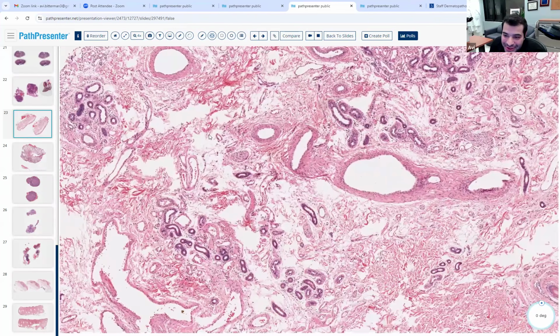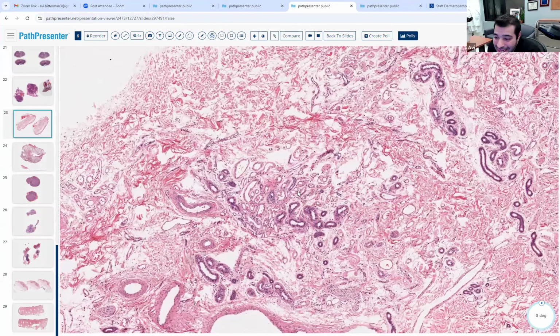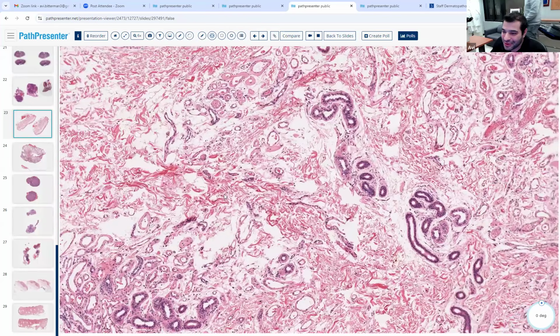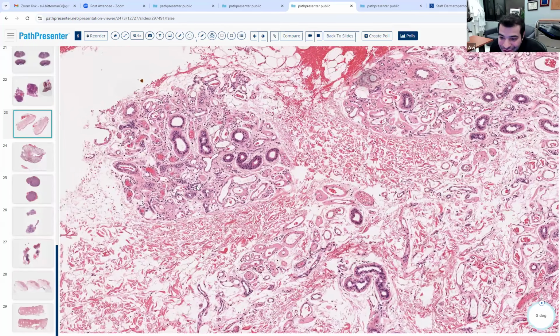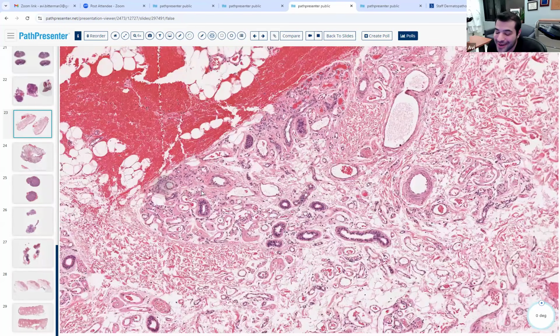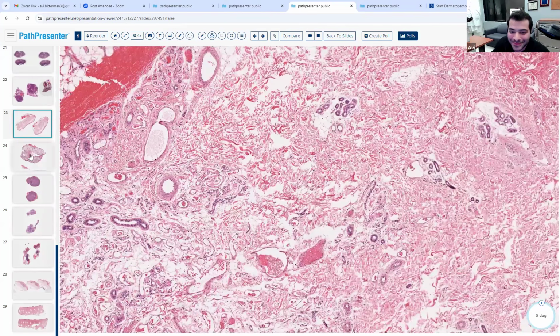So one of those things they may just throw in there. You notice that none of these are atypical. It's just a hamartoma. They're kind of normal, but there's just a whole bunch of them. The only thing abnormal is how much. This is just too much of a good thing, and too much of a good thing is a hamartoma. In this case, the name makes sense: too many eccrine, too many angio. Eccrine angiomatous hamartoma. Good job.